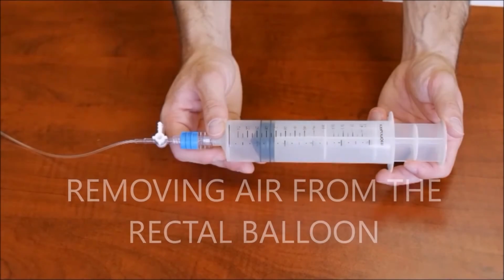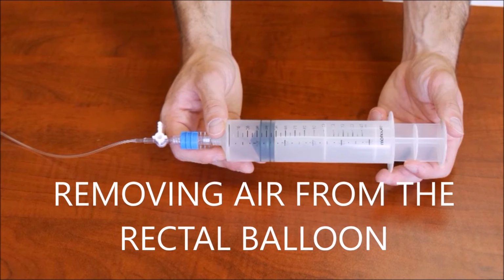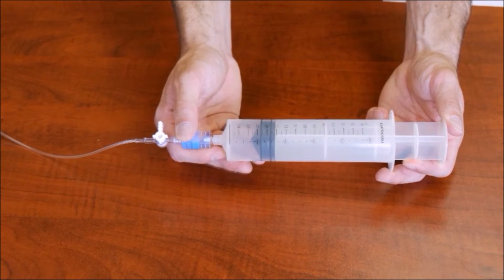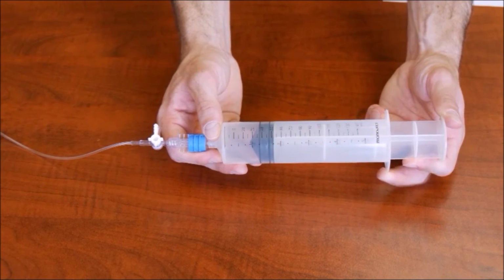When you want to remove air from the rectal balloon, leave the luer lock in the on position and make sure the flow control switch is also in the on position, and pull back on the plunger of the syringe.